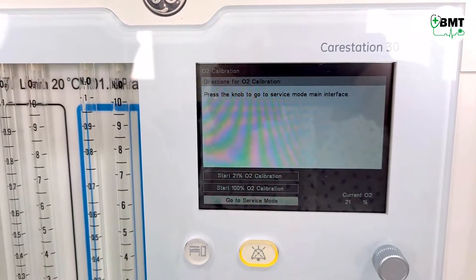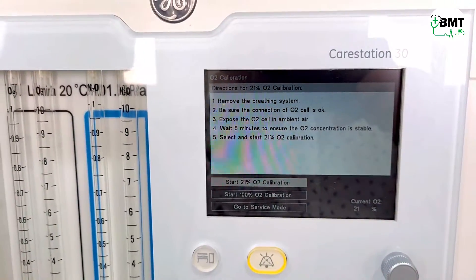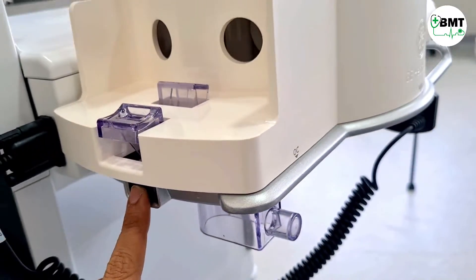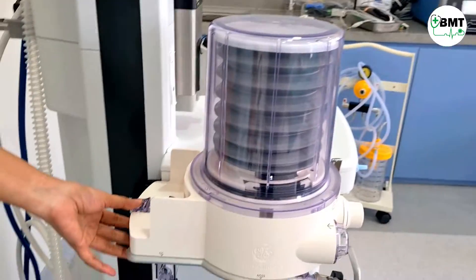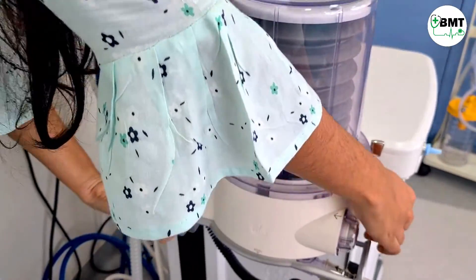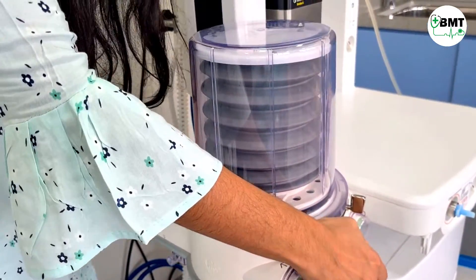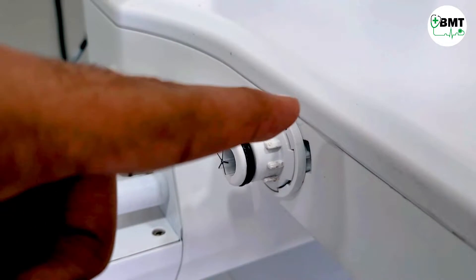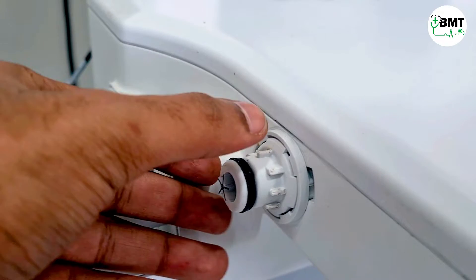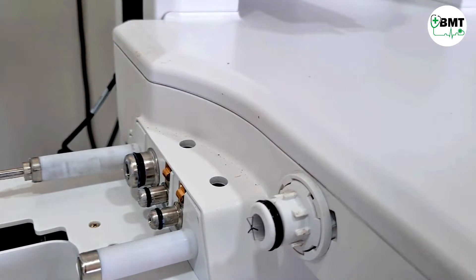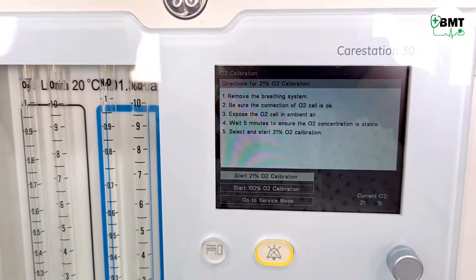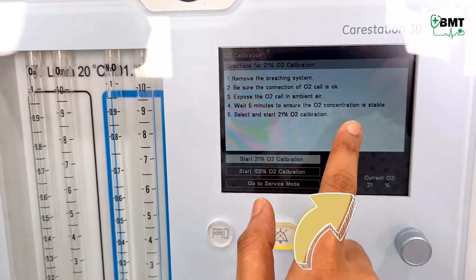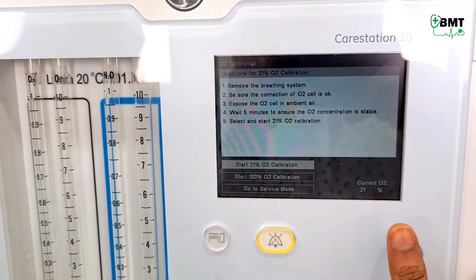In service mode, go to O2 calibration and press the knob to enter. Start 21% O2 calibration and remove the breathing circuit. Press the lock and pull it over — inside is the O2 sensor and its attachment, which can be removed with a plier. Whenever you remove the breathing circuit, the O2 sensor automatically gets exposed to air, so there is no need to remove the O2 sensor separately for 21% calibration. Ensure the O2 cell connection is secure, expose it to ambient air, and wait 5 minutes for the O2 concentration to stabilize. Then select and start 21% calibration.